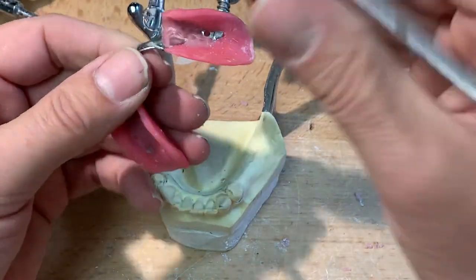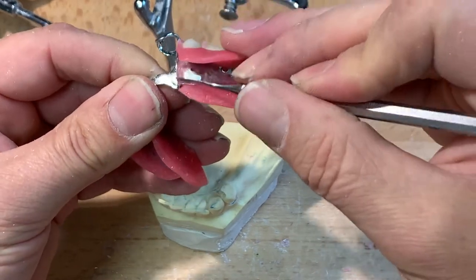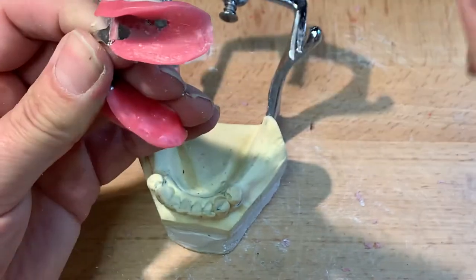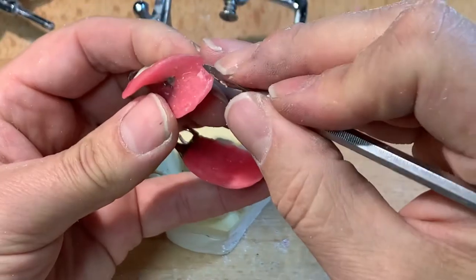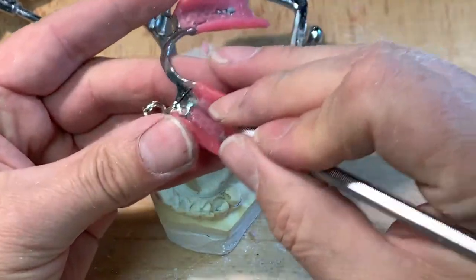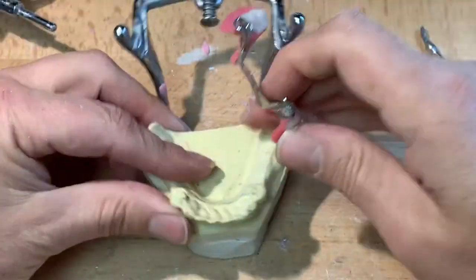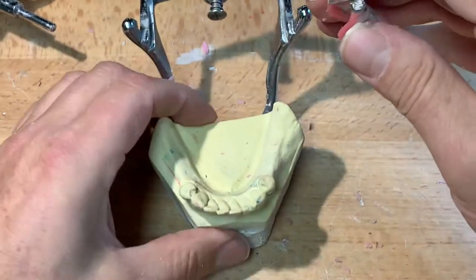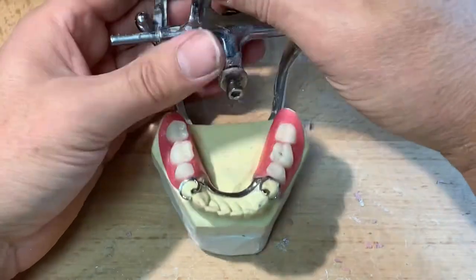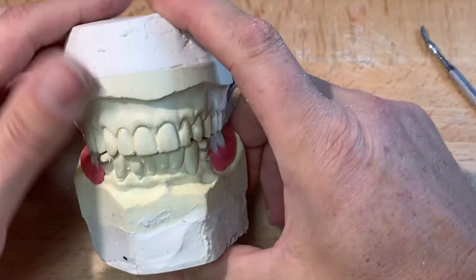Don't go underneath on the fitting surface. Even though I've got a little void here, I can either blend it in or leave it, because if I add wax there I run the risk of raising the flange off the ridge, which is an inadequate fit — an improper record. The model will be steamed, cleaned, wax cleaned, articulation smoothed out, identified, and verified, and then it goes for try-in.